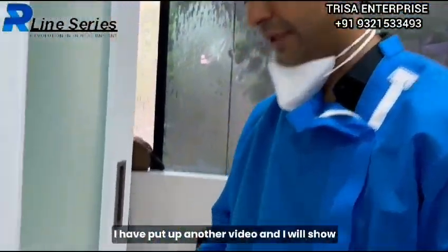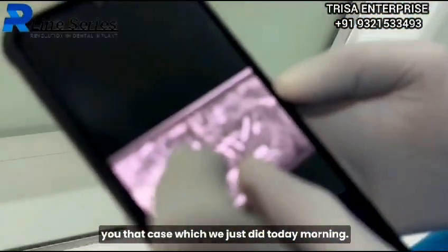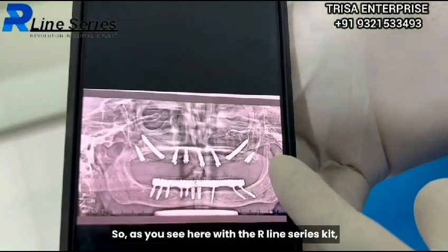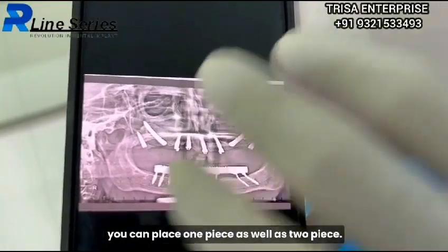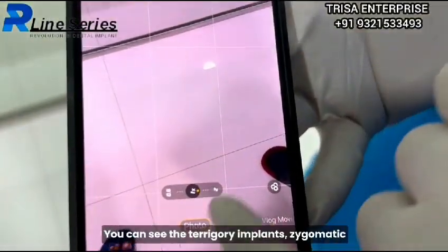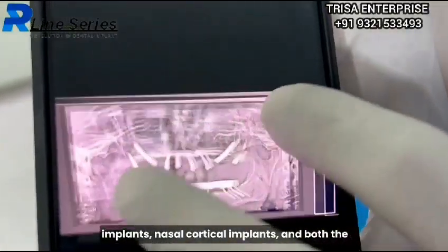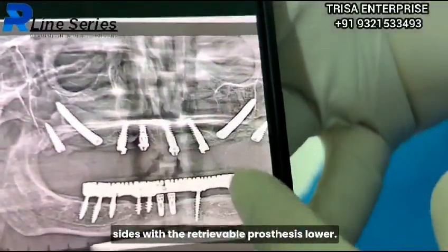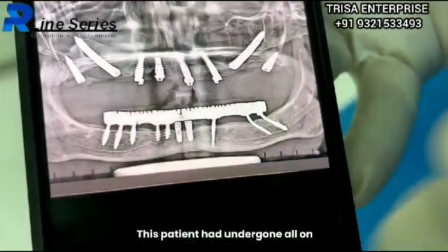Let me show you another case which we just did this morning. These are the R-line series two-piece implants. As you see, with the R-line series kit you can place one-piece as well as two-piece. You can see the pterygoid implants, zygomatic implants, nasal cortical implants on both sides with the retrievable prosthesis on the lower.